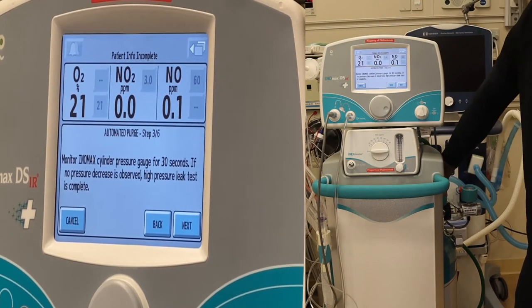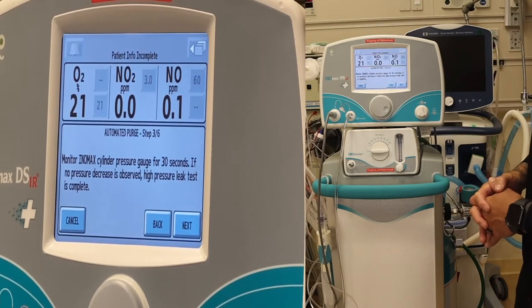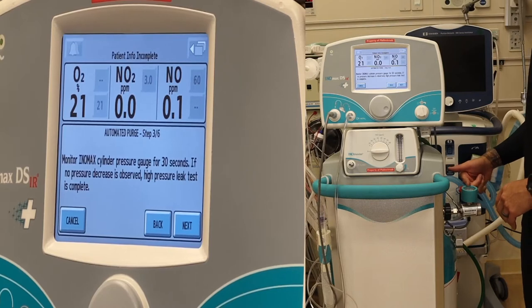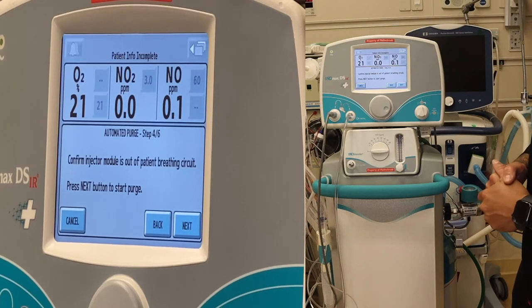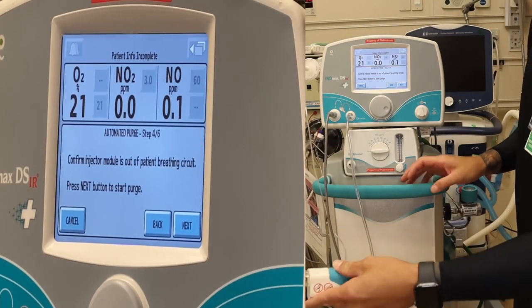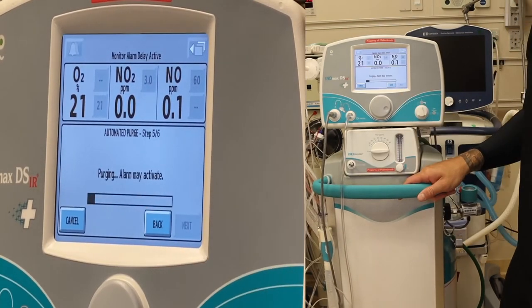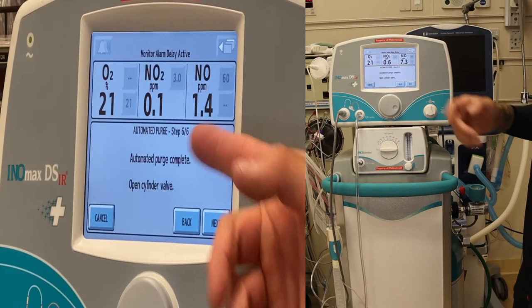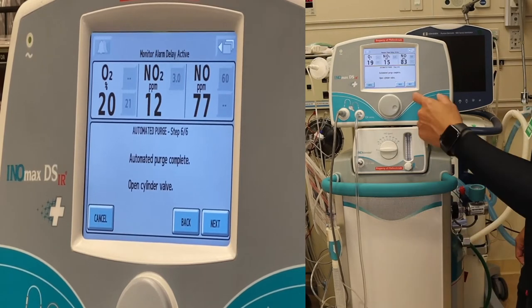Close the tank and watch the cylinder pressure gauge for 30 seconds. If no pressure decrease is observed, the high pressure leak test is complete. I still see 750 — no leak. Confirm injector module is out of the patient breathing circuit and press next. Injector module is not in the circuit — press next. Purge. Automatic purge is complete — open the valve. Reopen valve and press next.